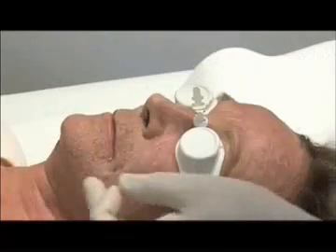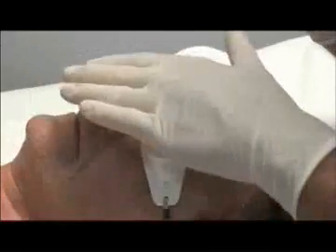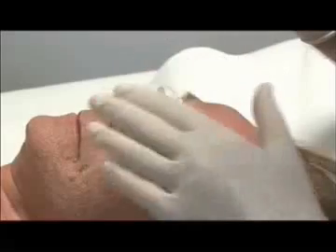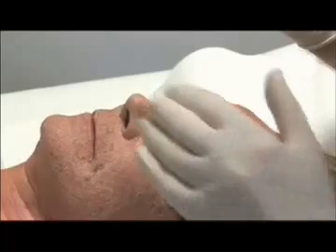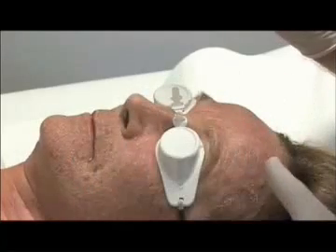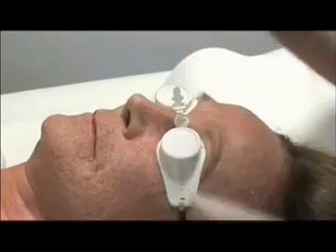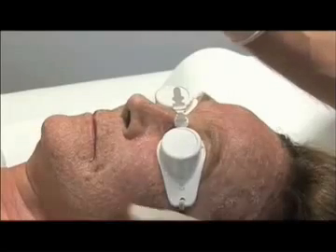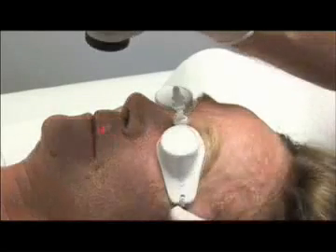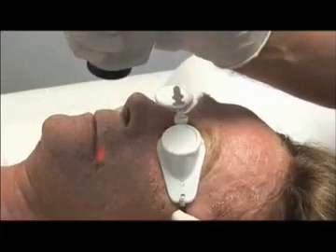Usually, the carbonized epidermal layer is removed using a cotton soaked in physiological lotion, and here we're going to leave it to act as a bandage in order to not go too deep and to therefore decrease the intensity of the burn, which will therefore considerably reduce the risk of burn side effects. As you can see, we're going over this carbonized epidermal layer that we have kept and will soften the intensity of the second passage. Here we go.